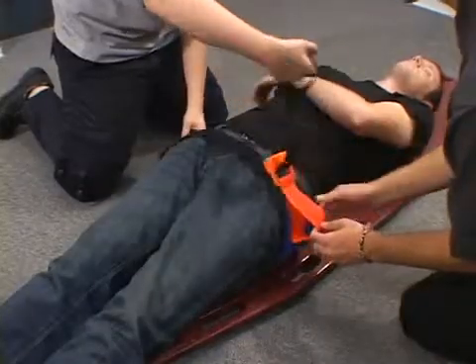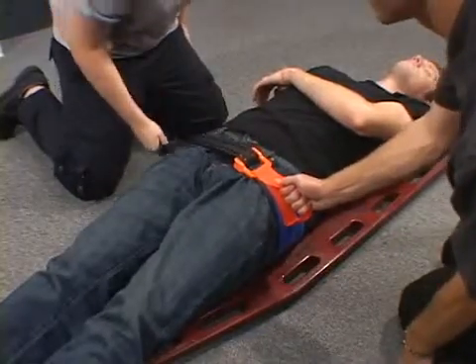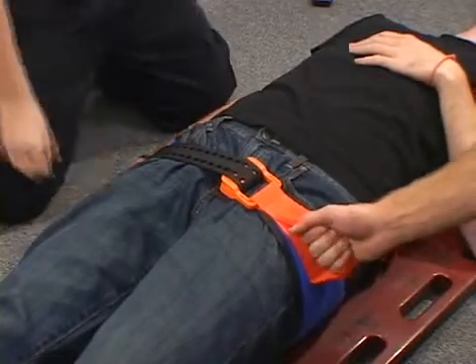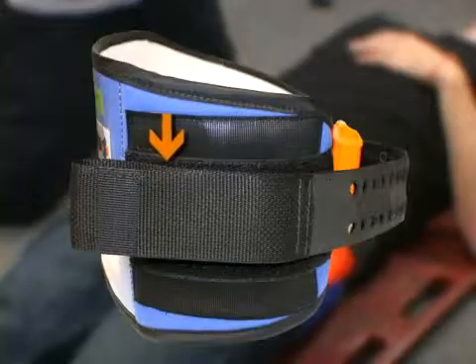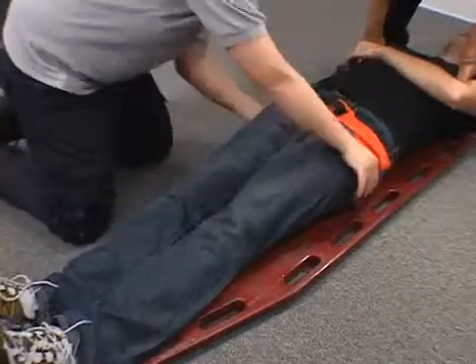Pull until you hear or feel the buckle click, or the belt stops. When you determine that the buckle has engaged, do not release tension. Maintain tension and firmly press the free pull handle against the belt. The Velcro hooks on the surface of the free pull handle will secure it in place. Do not be concerned if you hear a second click sound after the sling is secured.